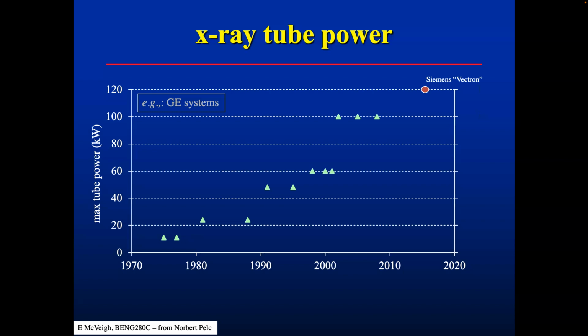And for example, we are at this point waiting, because this upgrade is so popular for our scanner, we're waiting on the new X-ray tube for the scanner that we have over in the Jacobs Hospital. And it will essentially double the amount of X-rays that are coming out, right? And that upgrade obviously isn't free, but it's well worth it.